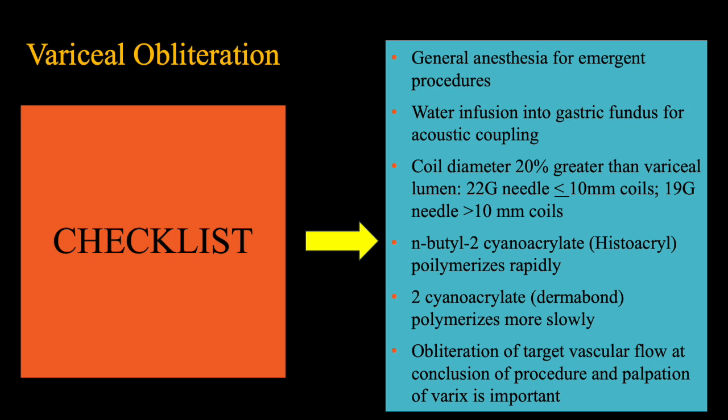It is important to demonstrate the absence of vascular flow at conclusion of the procedure. If needed, additional treatment should be delivered until there is a lack of flow. Also, if the varix is hard on palpation, it is reasonable to assume that obliteration has occurred.